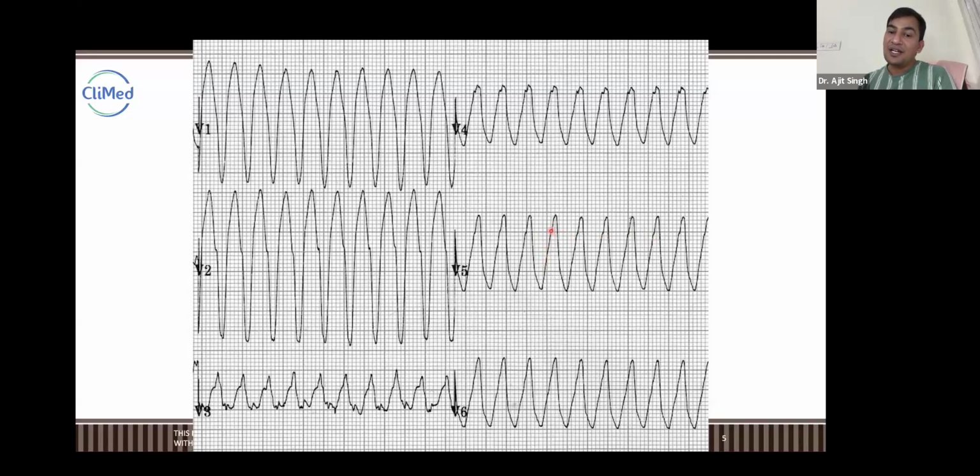Like from here, it is like R. QRS is positive. Here also from here, QRS is positive. So this is QRS, not this. You will see, no, no, sir, the edge is going downside also. Similar edges are going downside.